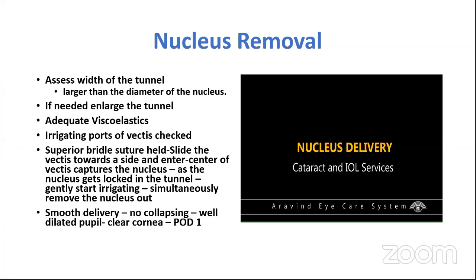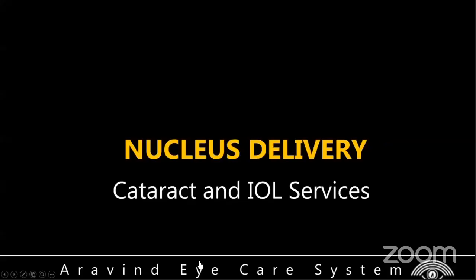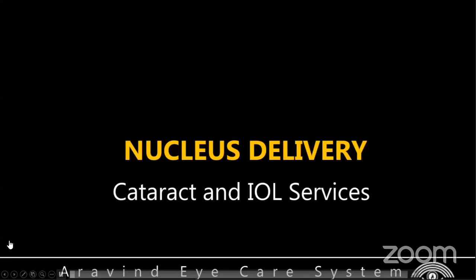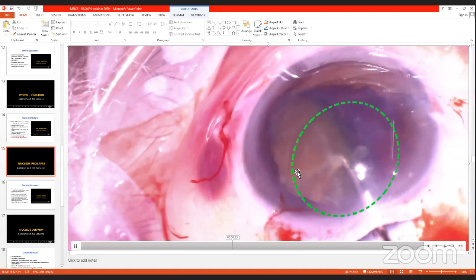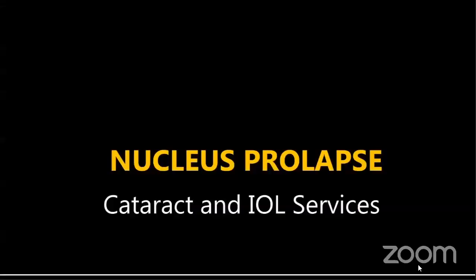And moving on to nucleus delivery. Sorry, I would like to make a small change here. Sorry. Now this is again a large rhexis comfortably being prolapsed.